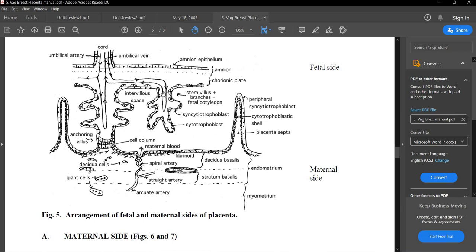We're also going to see lots of fibrinoid at the border between the maternal and fetal tissue — that's this dark pink material out here. Now let's go over the chorionic villi. Some of the chorionic villi are free in the intervillus space, whereas others are anchored onto the decidua basalis. These anchoring villi are connected by cell columns, which are made up of the peripheral trophoblast cells that line the outside of the chorionic villi.